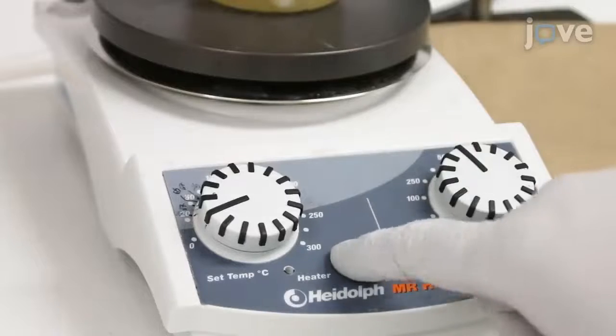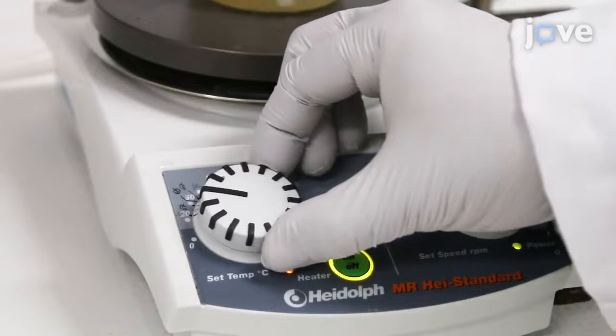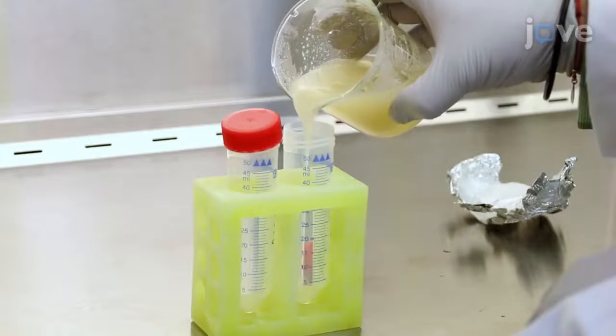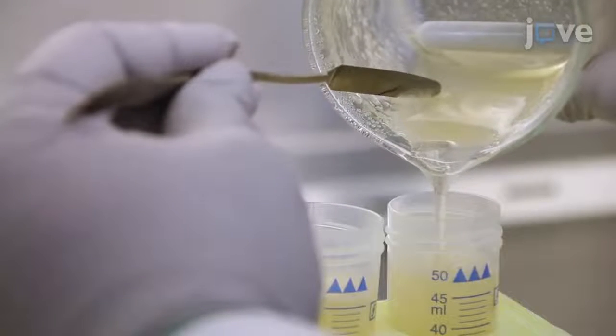Heat the solution at 37 degrees Celsius until the gel undergoes a phase transition to the liquid state. Then transfer the solution into sterile 50ml conical centrifuge tubes and seal them.